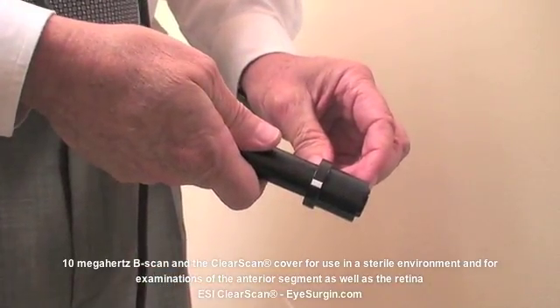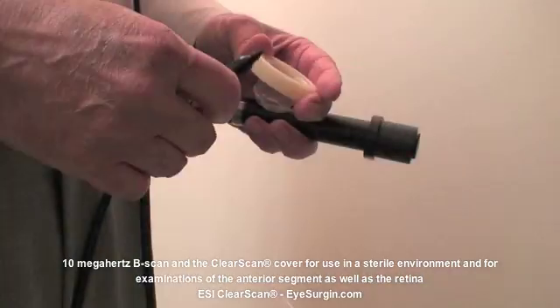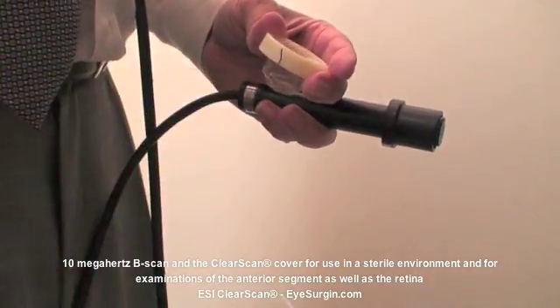After anesthetizing the eye with a local anesthetic, align the adapter probe marker with the line on the side of the probe. The adapters are available for various Quintel probes.